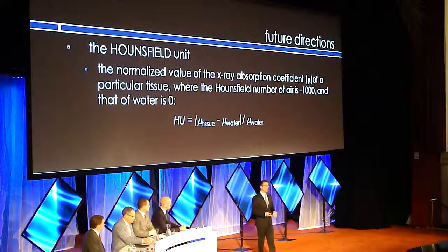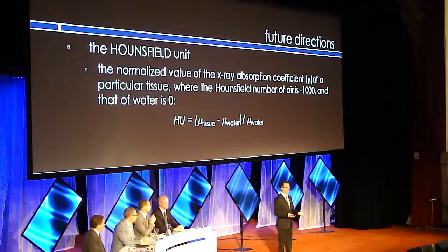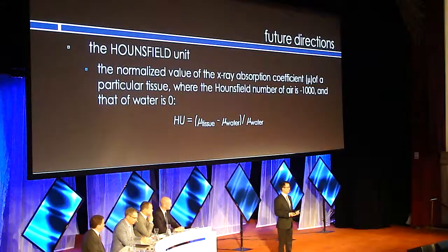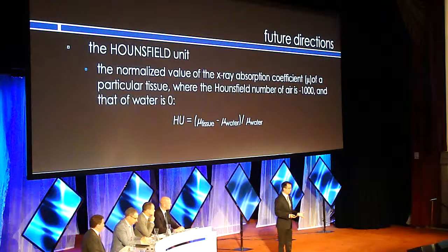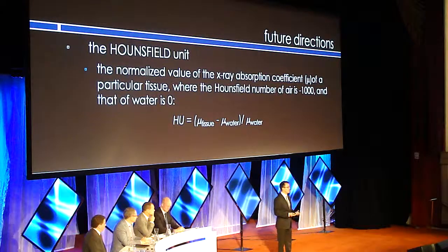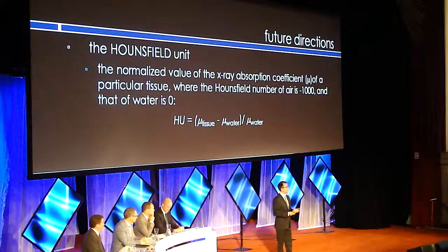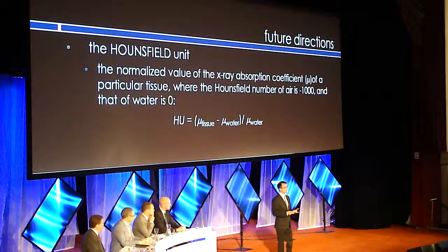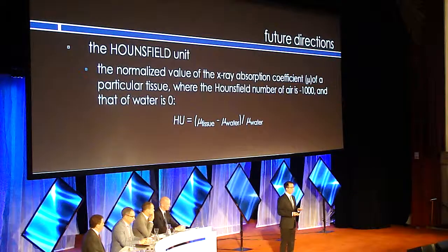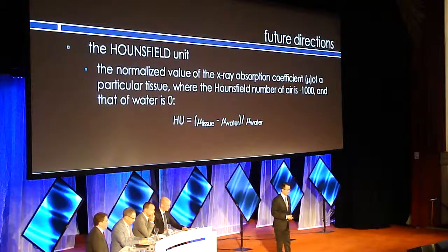So when you have a patient who you'd like to do some imaging on, one of the things that you have to consider for yourself or for the patient is how many implants do you think you want to place and where do you want to place them. And we typically will choose the smallest field of view size, and we'll choose a kVp and an mA that produces images that are of a high enough quality that overcomes electronic noise so that the images are most diagnostic.